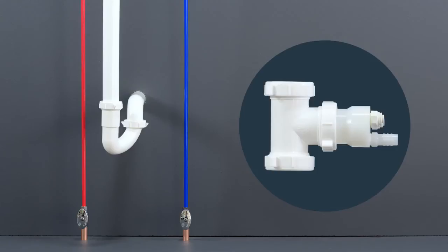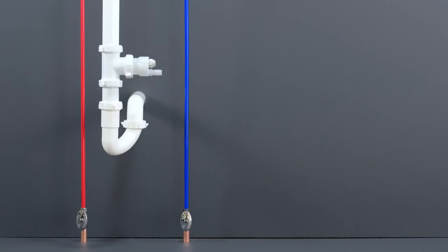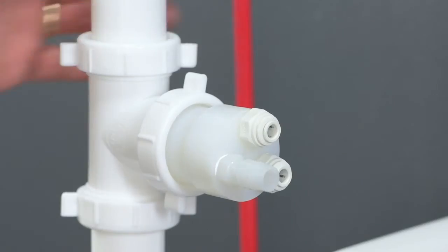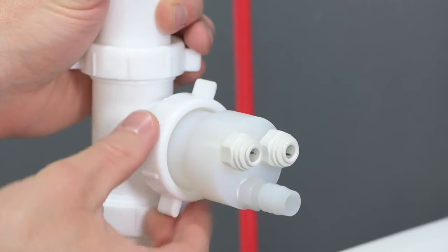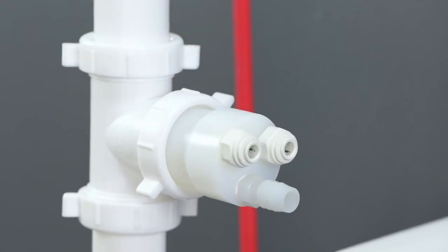Measure the drain T adapter assembly for placement into the drain piping. Cut and remove a small section in the appropriate place above the trap. Keep the entire assembly as low as possible while maintaining at least a 1 inch offset from the barb fitting as shown. Rotate the drain adapter hub so the barb fitting is at the 6 o'clock position. Be sure to tighten the slip joint T's nuts once all steps are complete. Now we're ready to connect the system.